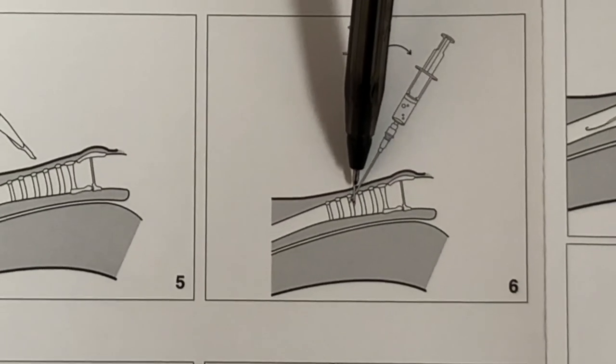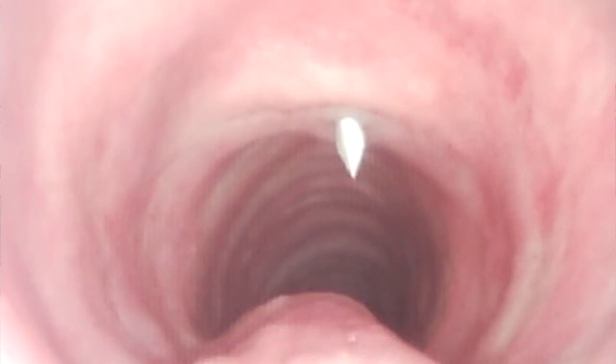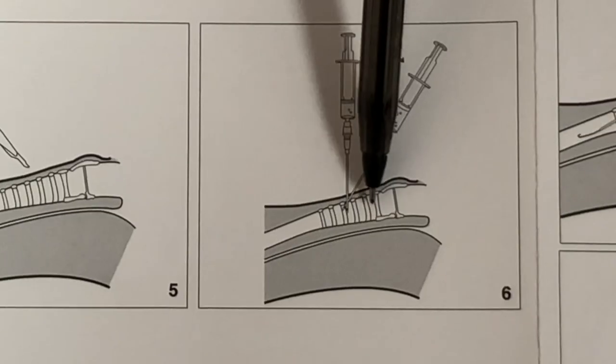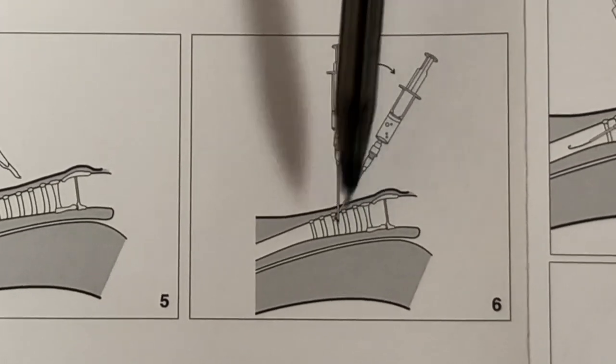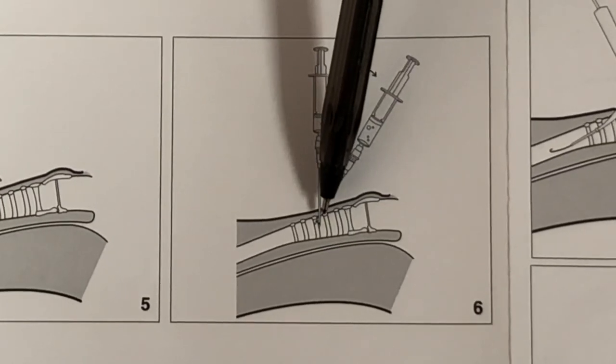Mentally make sure that not just the needle tip but the actual IV cannula is within the trachea. This is where, if available, it is mandatory to have a bronchoscope to detect that you have not gone too deep and damaged the posterior tracheal wall and that your IV cannula is indeed within the trachea.